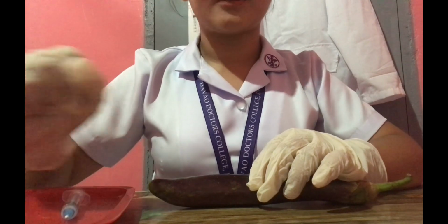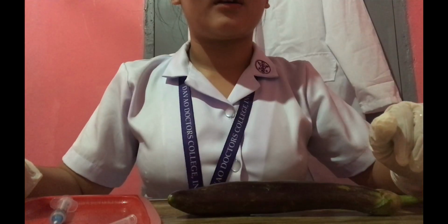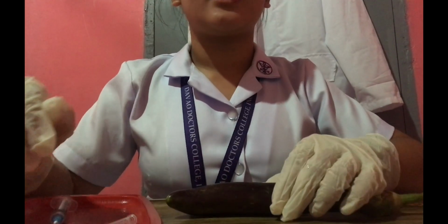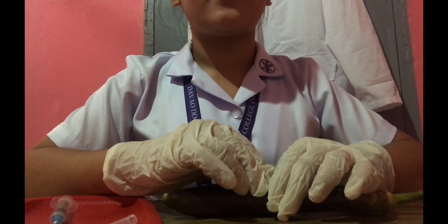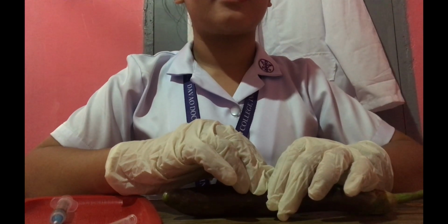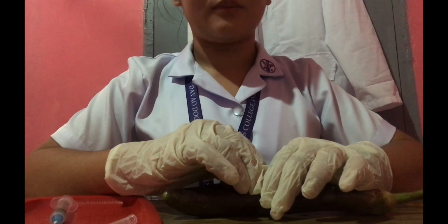Okay. So I already withdrew the needle at the same angle of insertion. Then apply pressure to the injection site. It is not necessary to massage the area of the injection site. If bleeding occurs, apply pressure with a dry sterile gauze until it stops. Then activate the needle safety device or discard the uncapped needle and attached syringe into the proper receptacle.